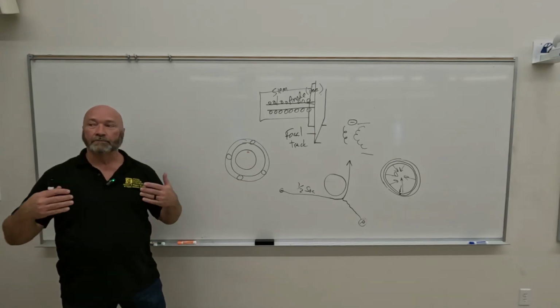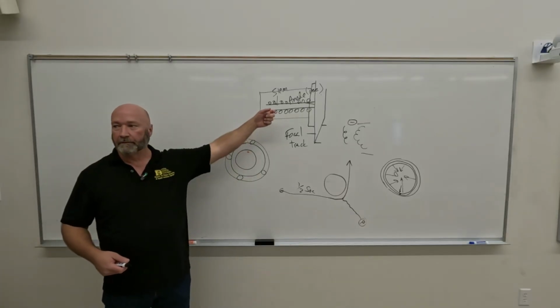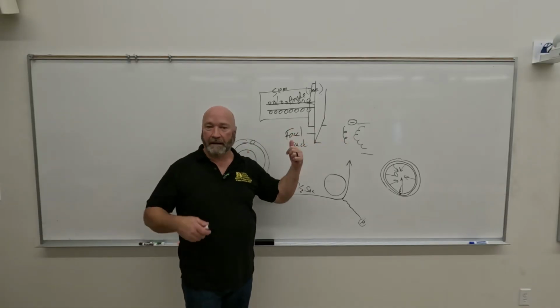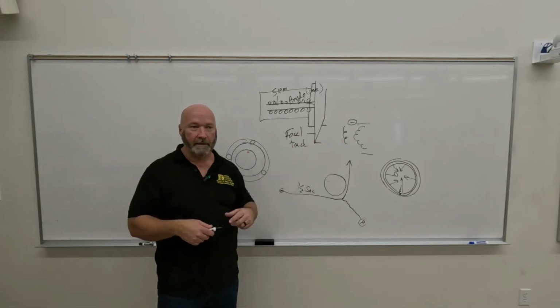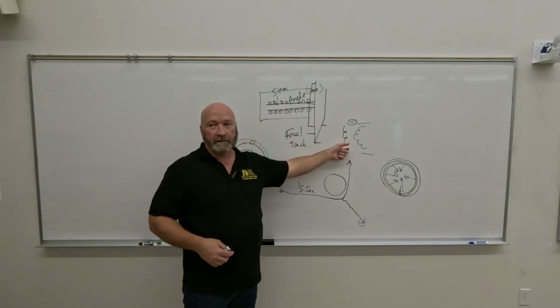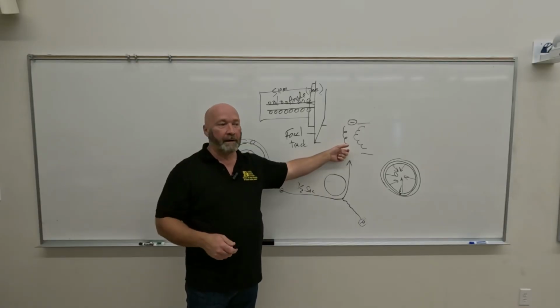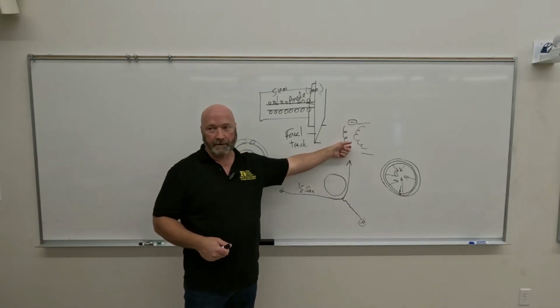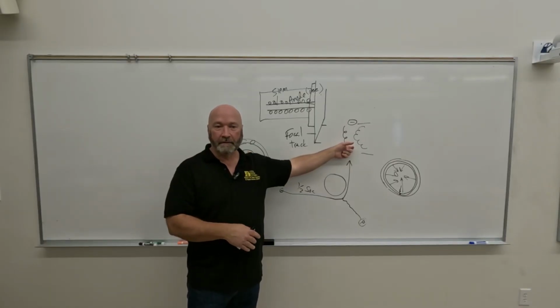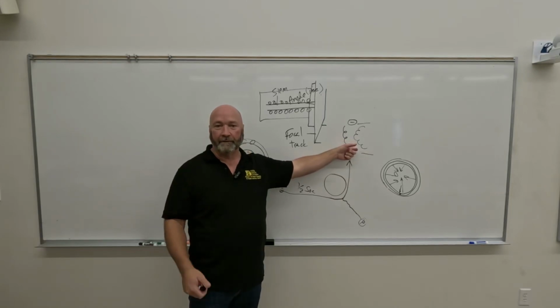All right. So just the time spinning the anode will create heat. Even if we don't create a space charge, we still create heat just rotating the anode. Okay. So we're not going to rotate the anode without creating a space charge in the prep stage. But once we make the exposure, where's our space charge? On the focus cup. It's gone. We make our exposure, we don't have a space charge anymore, right? You get off the button.